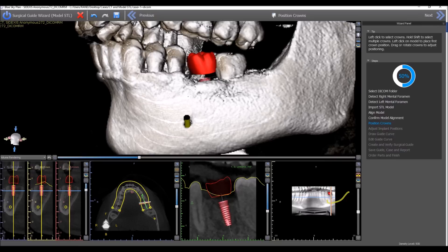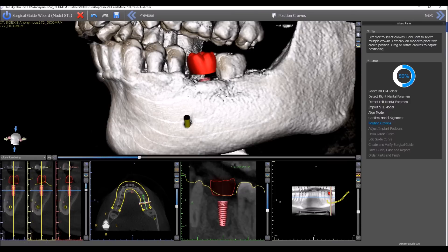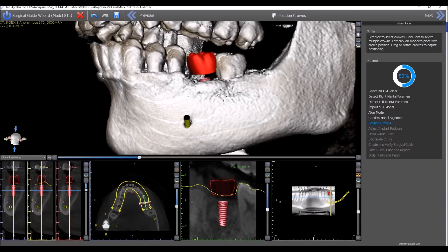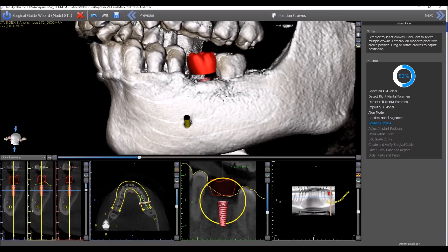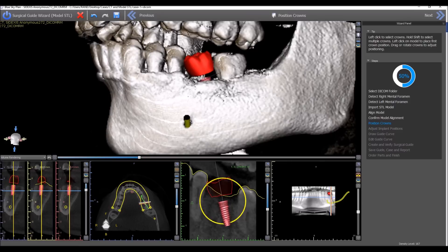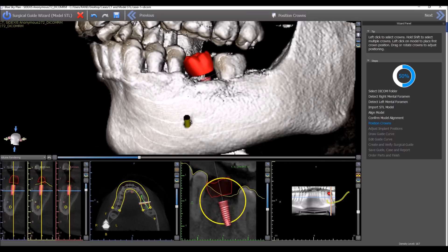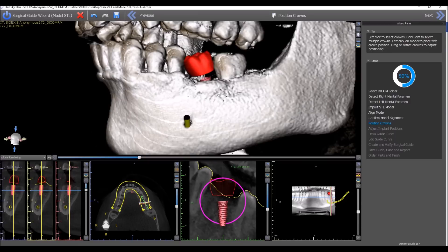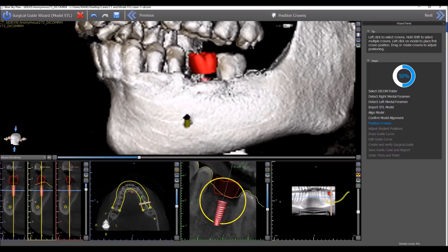You can now click on the second icon from the top that will make the tangential view implant-centered, with the implant remaining vertical the entire time. You can now keep the implant vertical and rotate around the implant. If you want to rotate to the implant, you rotate it the same way. You can see I'm rotating it and it's no longer vertical. However, when I let go of the mouse, the implant becomes vertical and the surrounding image updates accordingly.